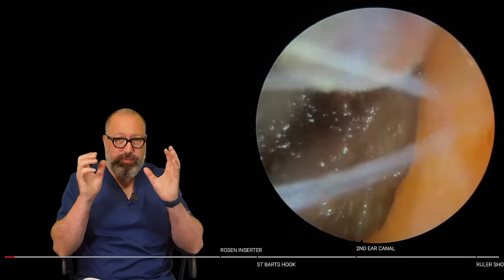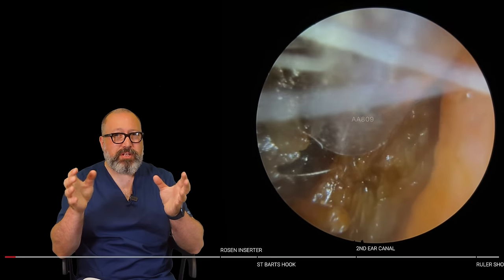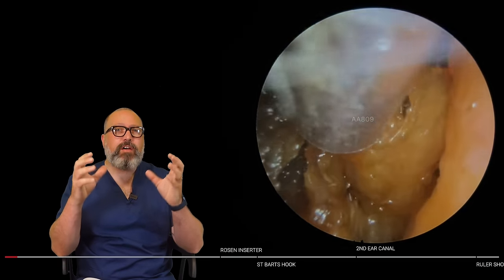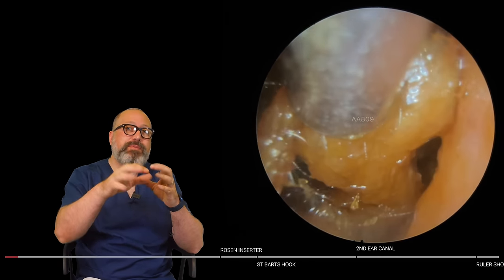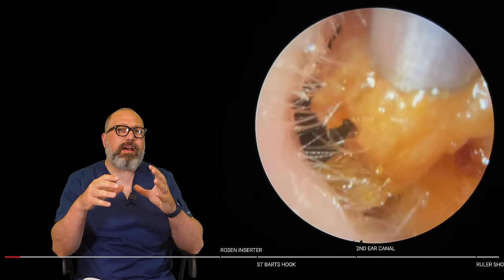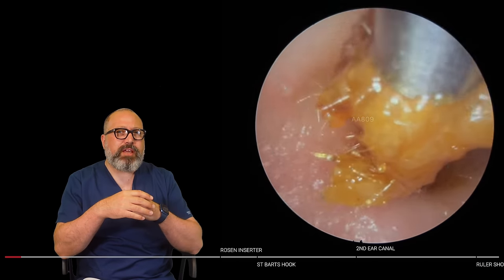Lovely patient, who has basically been experiencing lots and lots of hearing issues, and you can see why. This ear canal is jam-packed full of both wax and skin. The piece we're taking away here is just a little bit of skin that's been hanging around the side of that wax plug, so we're going to get rid of that first of all.